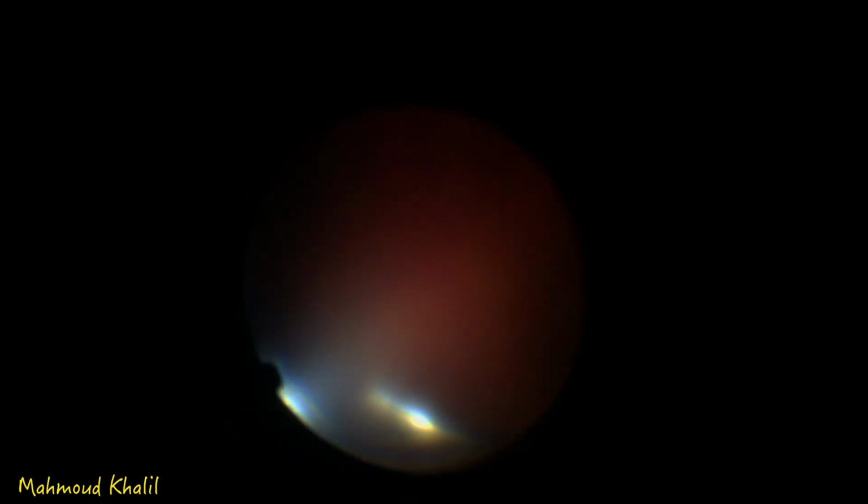Sometimes there is a difficulty in identification of the retina below, so opening a hole inside this vitreous hemorrhage in the superior nasal quadrant is the safest site until seeing the retina below, and then starting to completely remove the vitreous hemorrhage with the landmark of the retina identified after opening of this hole.